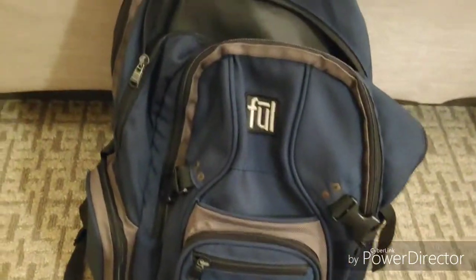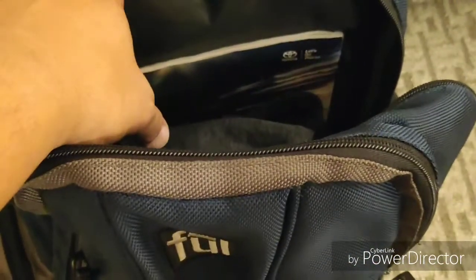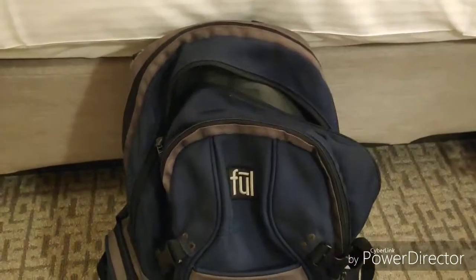So traveling with a CPAP, auto CPAP, it's not too hard. If you have a nice size backpack, you can actually put your CPAP in your luggage. I usually put my CPAP in here along with some of my clothes. So it stands up here with the power cord and the tubing with my mask. Then I have my laptop. Then I have some of my other gadgets on the front. And I'm good to go.